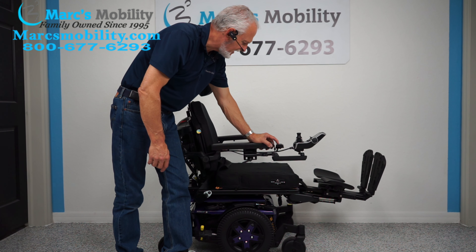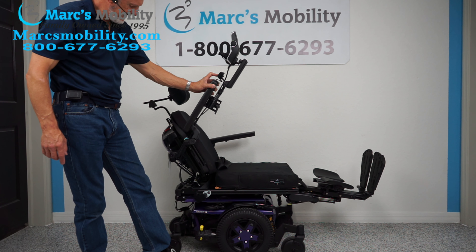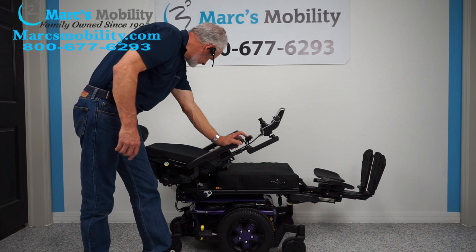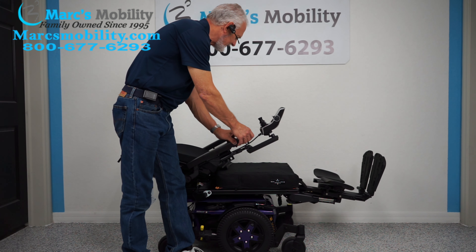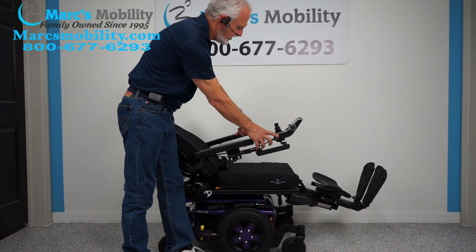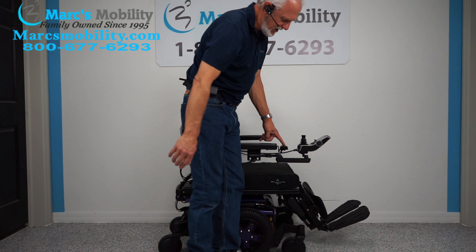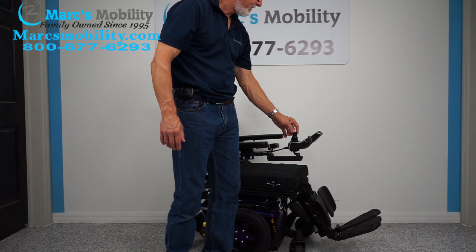I'm going to bring the tilt back down. The last function is called the electric recline — that's when the back goes back by itself. Watch the back go back. That's the electric recline — it's pretty much a full recline. I'm going to bring the recline and the legs back down at the same time; I'm doing two buttons at once. If you want to do two functions at once, you can also do it through the joystick. When you're outside, leave your legs out a bit for a little more clearance.